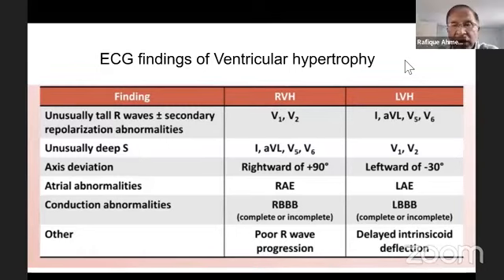The question is hypertrophic cardiomyopathy with the short PR. It's not always present. It's just where the P wave is coming from. And also two factors. One, is the P wave coming from really high up in the sinoatrial node or in the lower part of the sinoatrial node? And that will change the PR interval.